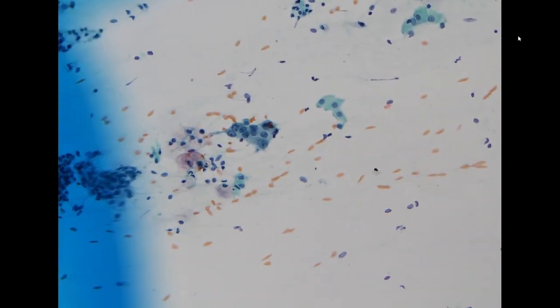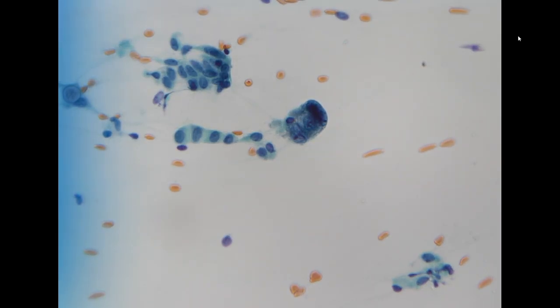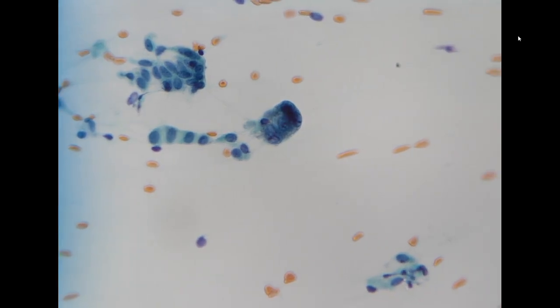And then we start to see something like this. This is what we call an alien pattern, that it is out of nowhere. When we see something like this, we should think about the possibility of extrauterine origin. Here, again, we start to see a little bit more, and this high NC ratio is a very atypical arrangement.